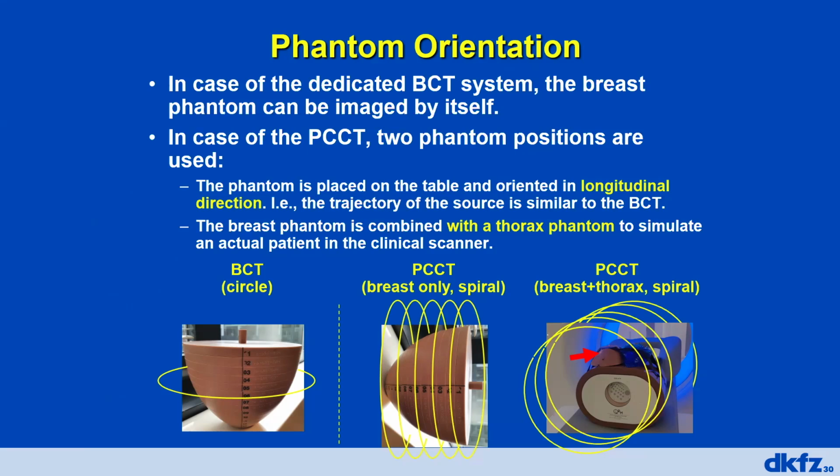It sometimes causes pain and also might limit the number of patients that come back to these kinds of examinations. So our hope is that using the high spatial resolution of photon counting CT, we at some point can do breast imaging with clinical scanners and replace mammography. However, this is years or 10 years, something like that off.